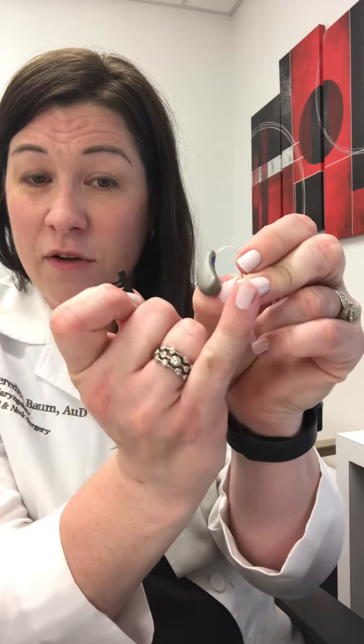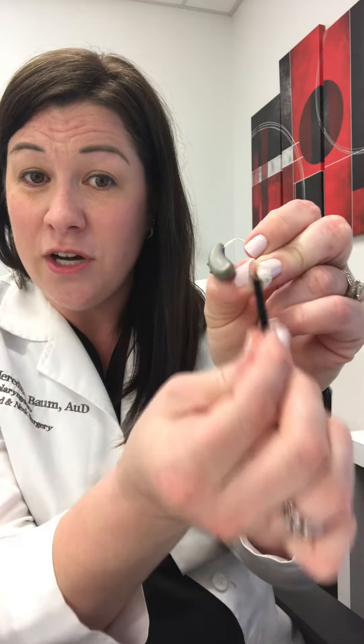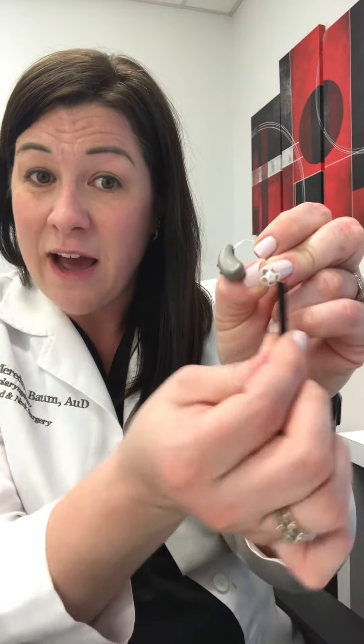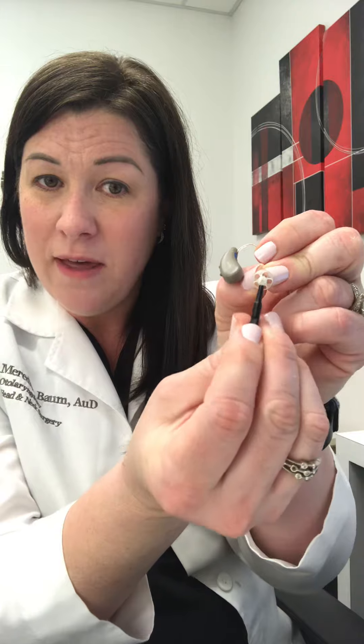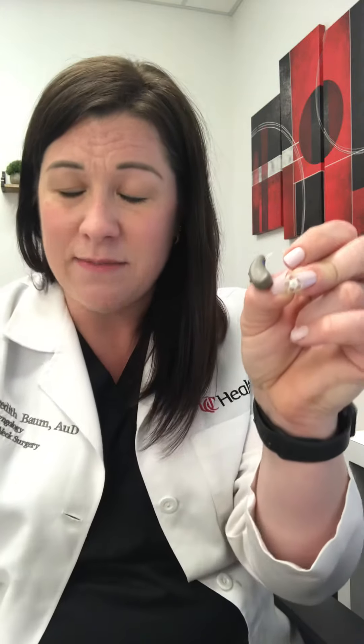Most of the Signia hearing aids utilize these click domes — the little rubber tip on the end. At night, when you take it out of your ear, the best thing to do is look at the end of that hearing aid and give it a brush with the brush we provided you with to clean it out real good. If you see any wax in that center hole right in the middle, you can try to pick out any wax that might be in there.